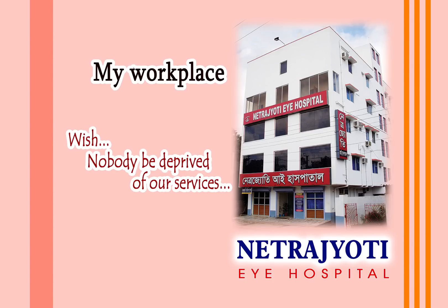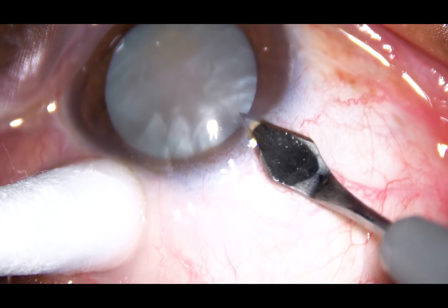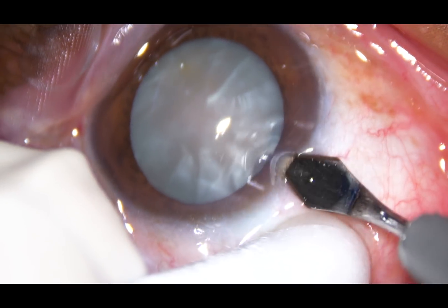Friends, welcome to my hospital at Ranaghat, India. In this video, you are going to see phacoemulsification of an intumescent cataract.